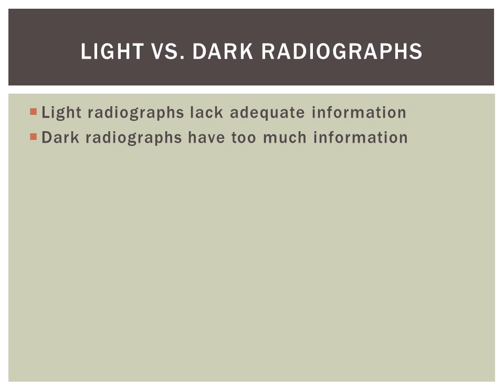Light versus dark radiographs. Light radiographs lack adequate information, where dark radiographs just have too much information. So which of those do you think would really be better? Obviously, darker images have too much information, and that's better than not having enough. With that being said, we still look at ALARA, and we still need to make sure that we have our techniques at an adequate level.